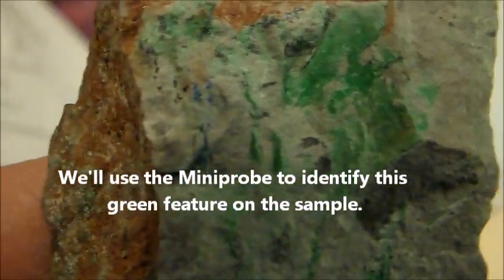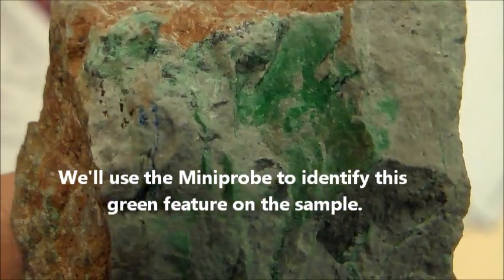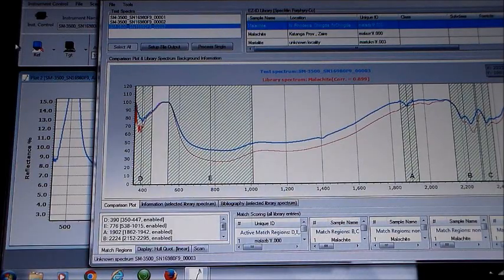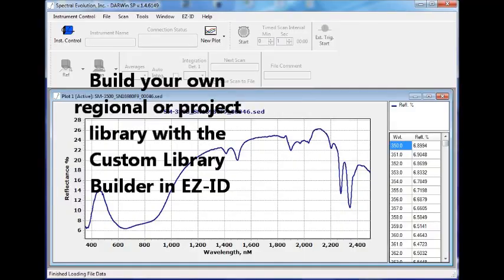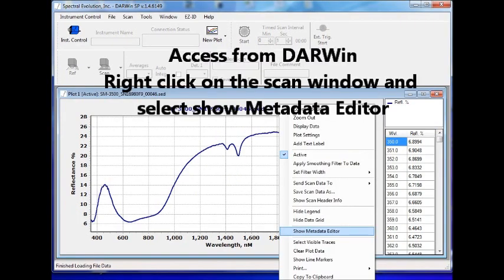Now we'll identify a green feature on the same sample. This time we have chosen the Specmin library and EasyID matches to a sample of malachite. You can build your own library by selecting the Custom Library Builder option from the EasyID tab in Darwin. Start by right-clicking on the Scan window in Darwin to show the Metadata Editor, which will appear below the Scan window.